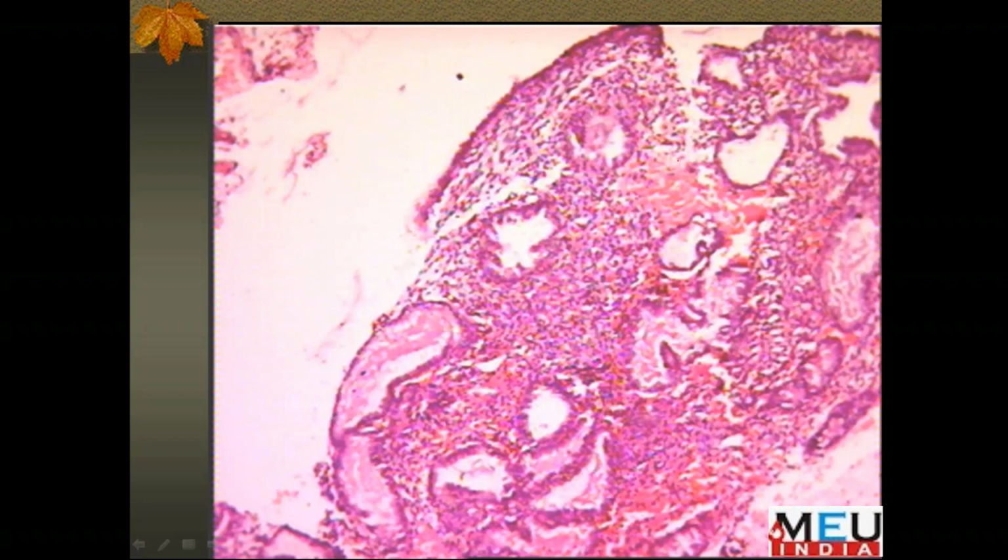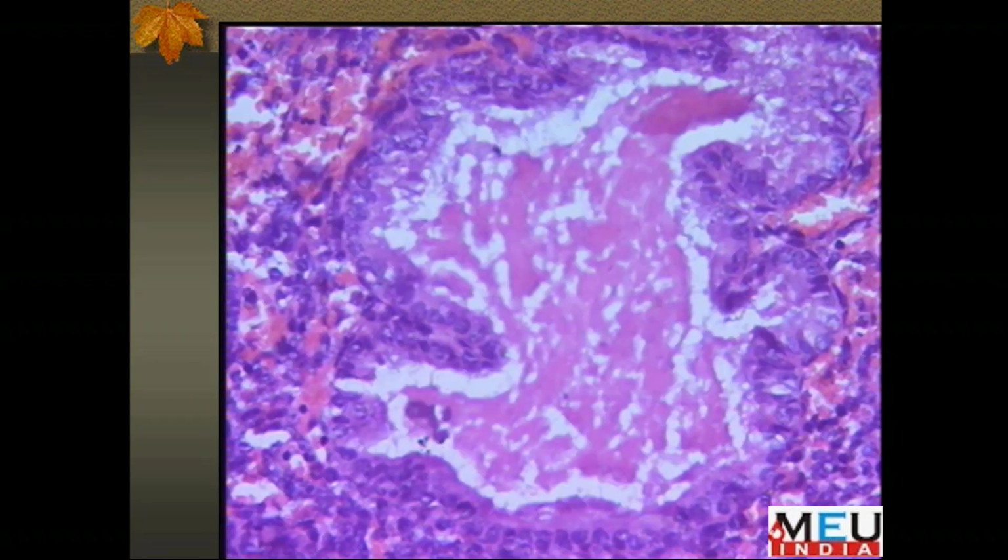This is the blood vessel, and around it a perivascular cuff has appeared, and around the 25th day, or 11th post-ovulatory day, there are islands of pre-decidua, a superficial compactum, and the edema has again decreased, and we find that congestion or bleeding has started taking place inside the stroma.